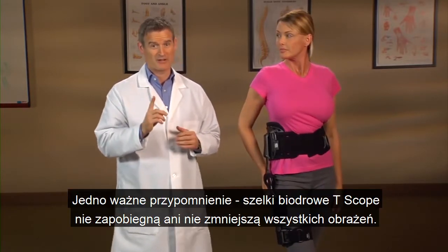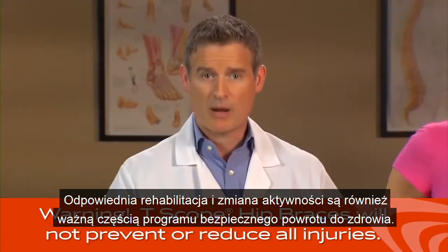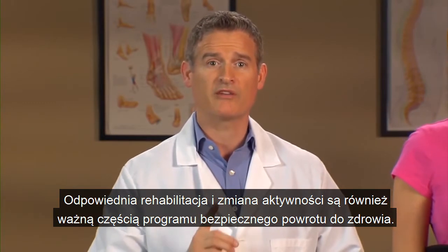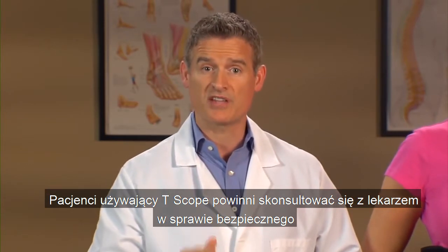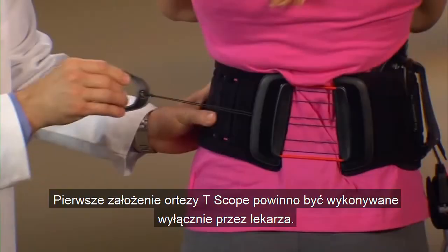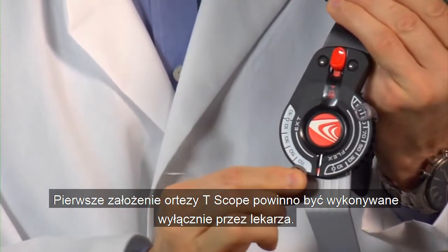One important reminder: T-Scope hip braces will not prevent or reduce all injuries. Proper rehabilitation and activity modification are also an important part of a safe recovery program. Patients using T-Scope should consult with a medical professional regarding safe and appropriate activity levels while wearing this brace. The initial application of the T-Scope hip brace should be performed by a medical professional only.